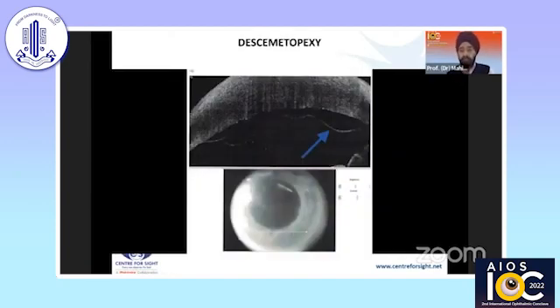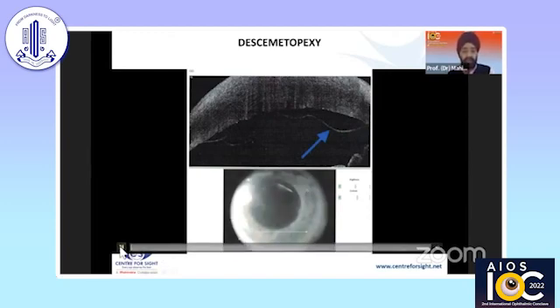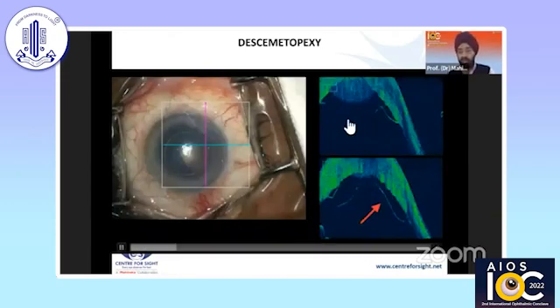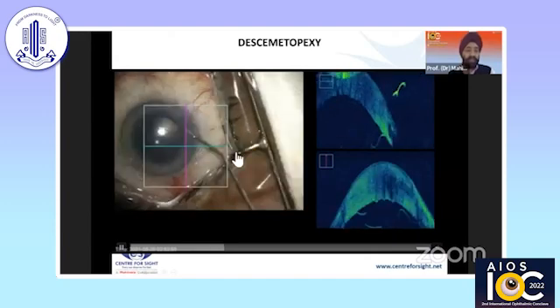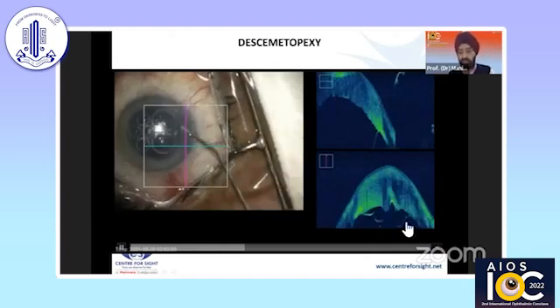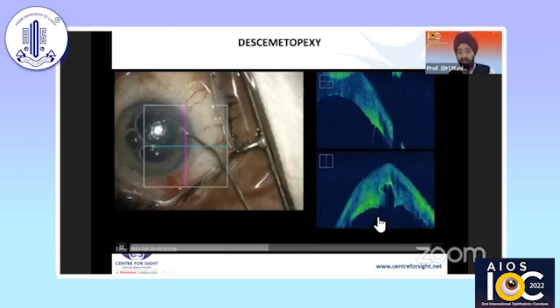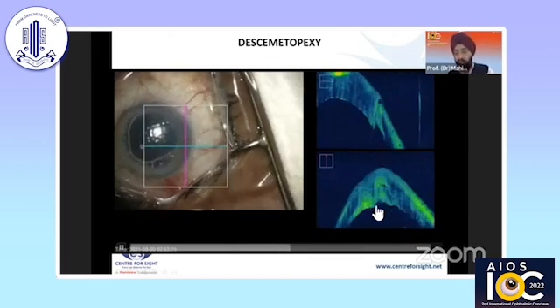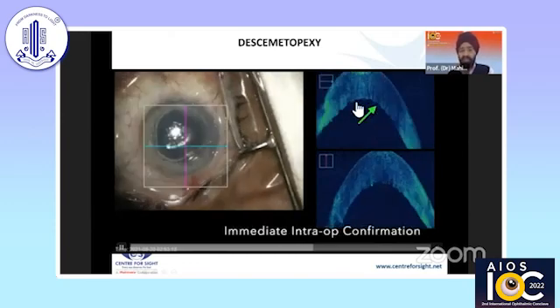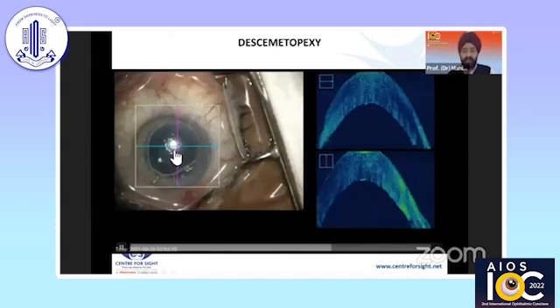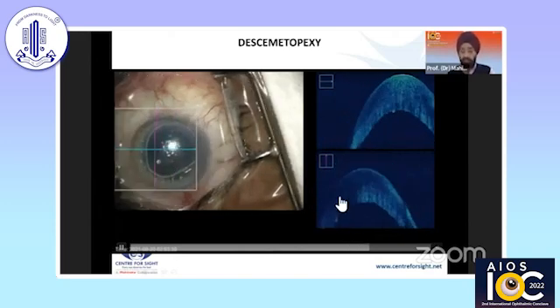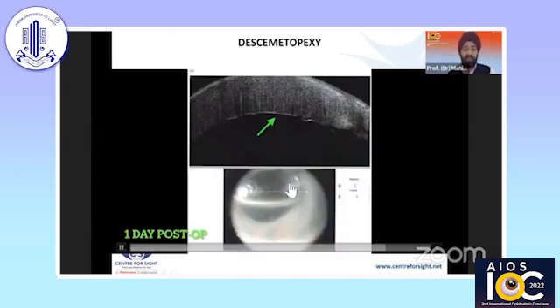This is the integrated intraoperative OCT — Tetyal and Namrata have done a lot of work in their group. You can see the same patient with Descemet's detachment and how we can use intraop OCT to see in real time whether the Descemet's detachment is settling. There is a huge detachment, we are sitting temporally and going from the inferior part. As the air bubble comes in, you can see the Descemet's detachment getting attached intraoperatively — a fantastic visualization. One day post-op, the patient recovered good vision.